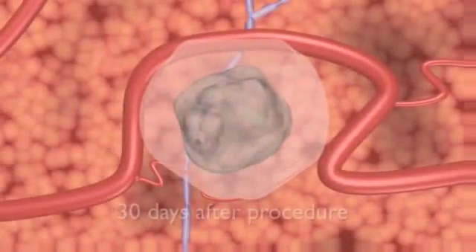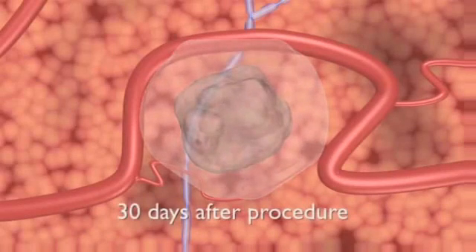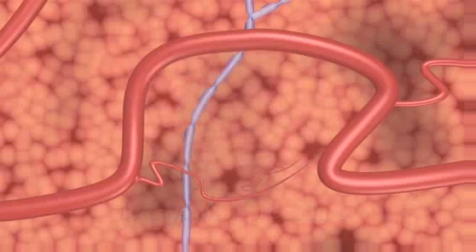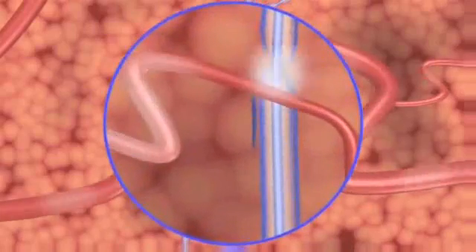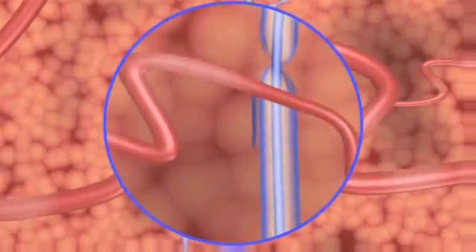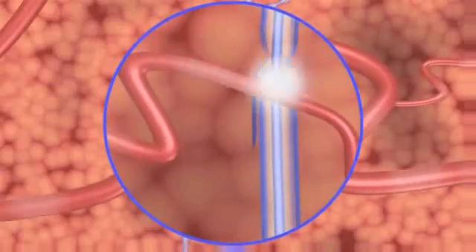30 days after NanoKnife surgical ablation, CT and ultrasound imaging reveal a mostly normal appearance with little remaining evidence of the IRE treatment as seen on imaging. Critical structures continue to function normally, and blood flow in the treated area aids healing and minimizes potential treatment side effects.